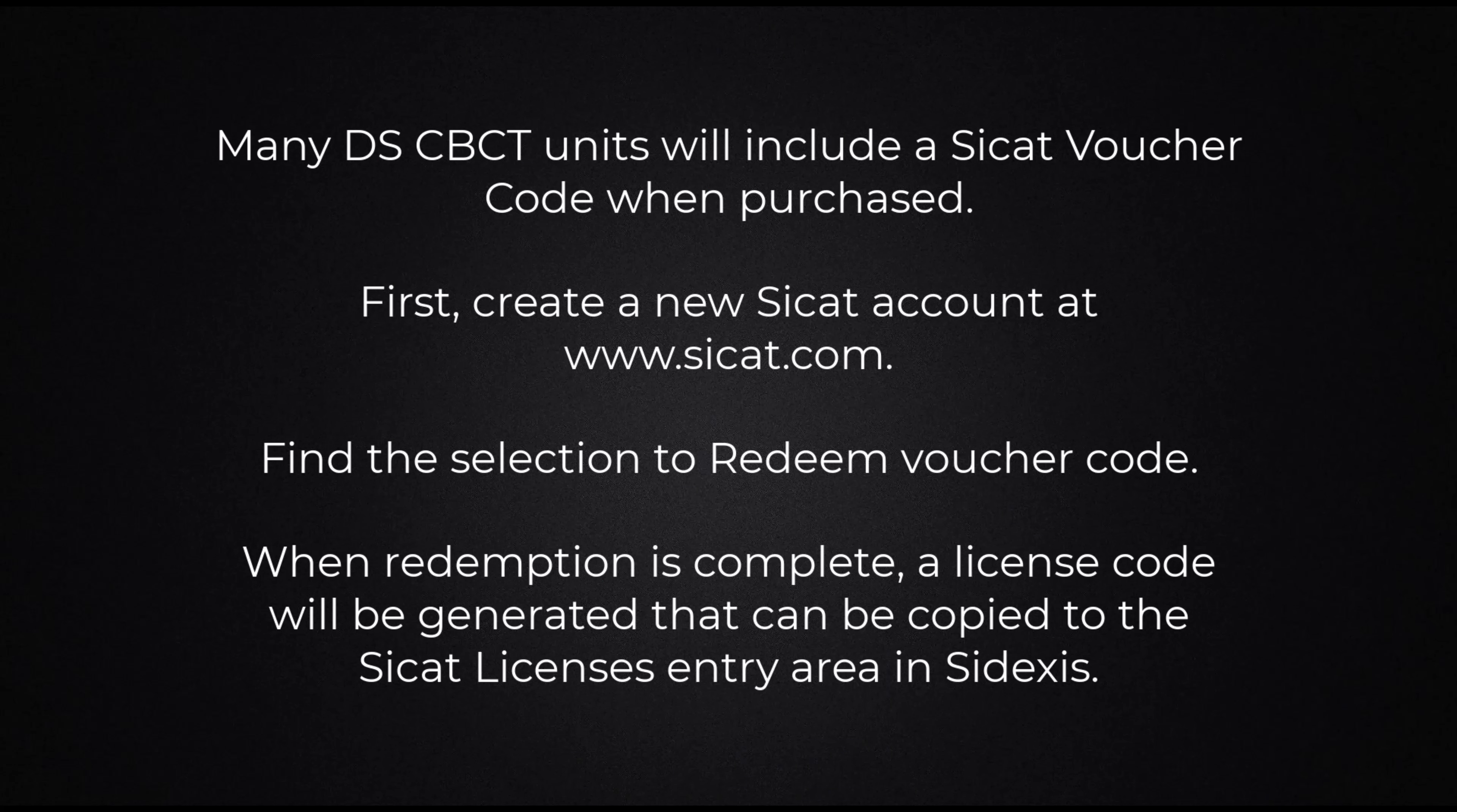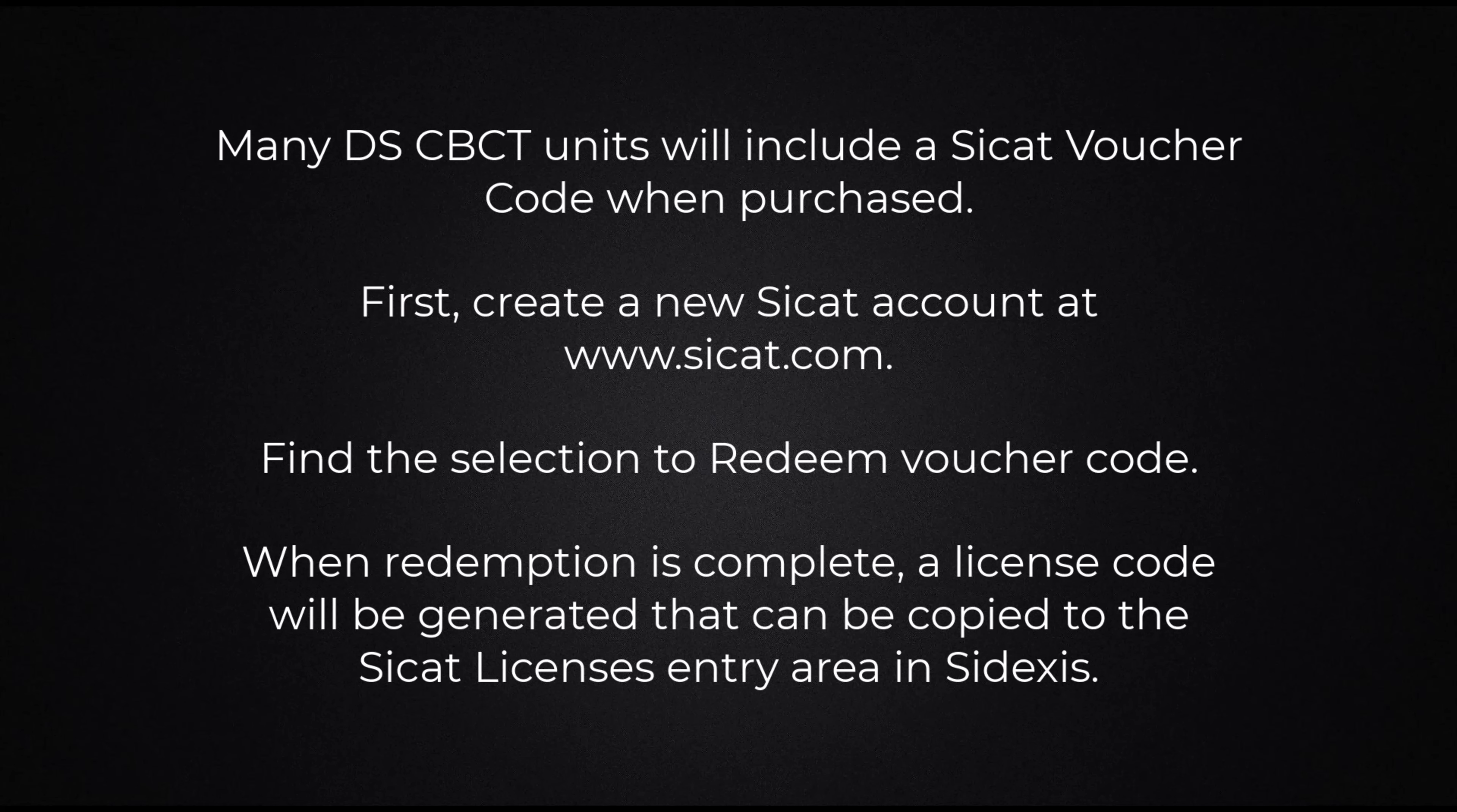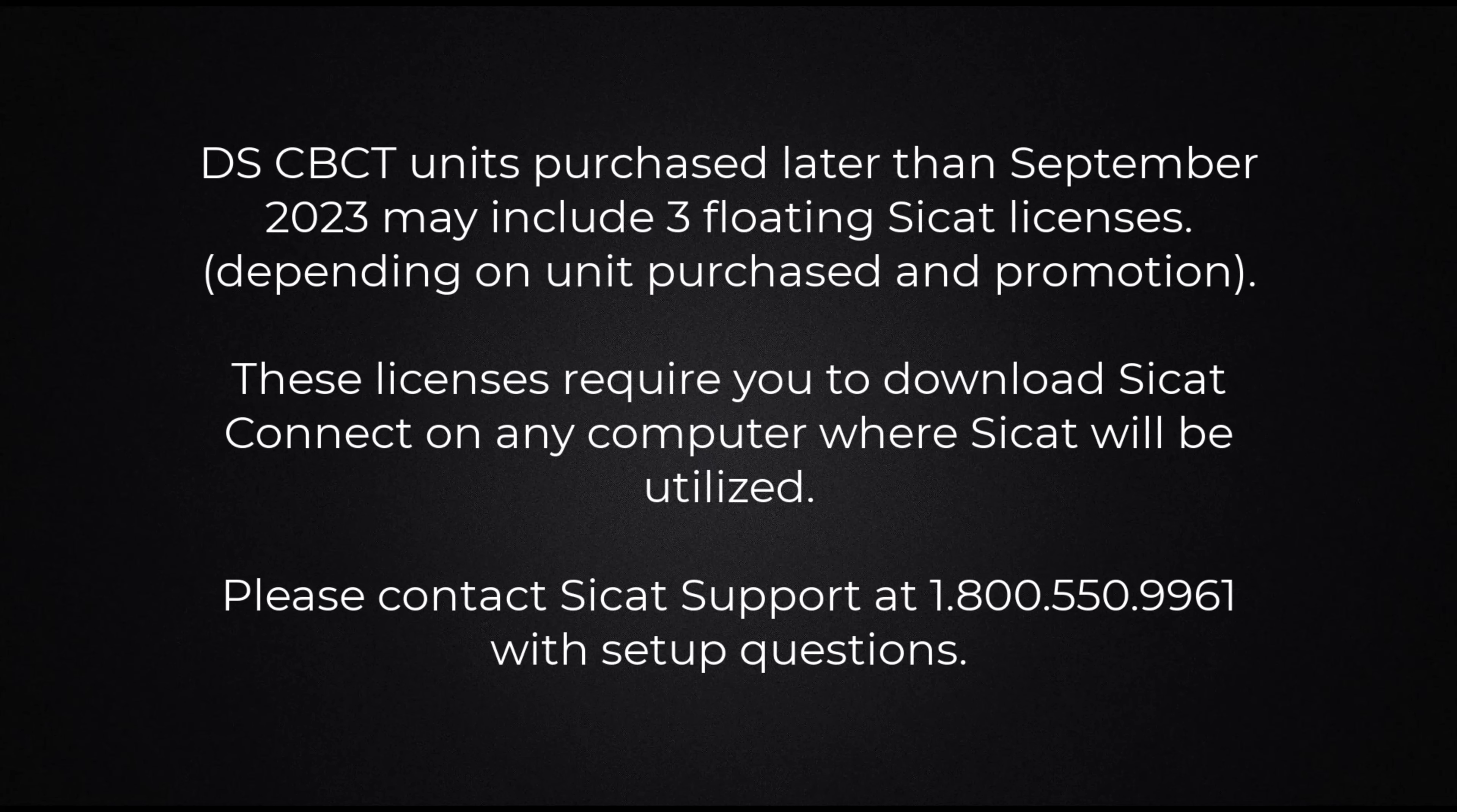Many DS CBCT units will include a Sicat voucher code when purchased. First, create an account at sicat.com. Find the selection to redeem your voucher code. When redemption is complete, a license code will be generated that can be copied into the Sicat license entry area inside Sidexis.